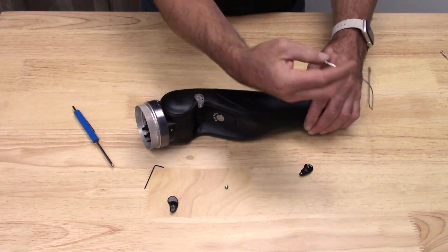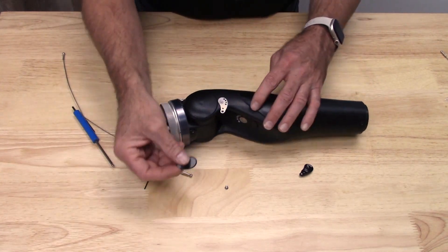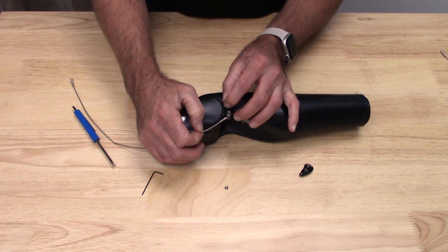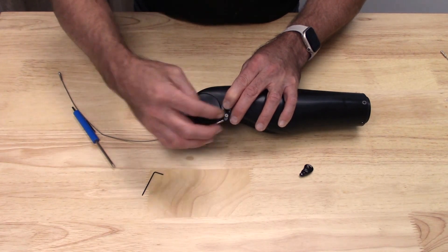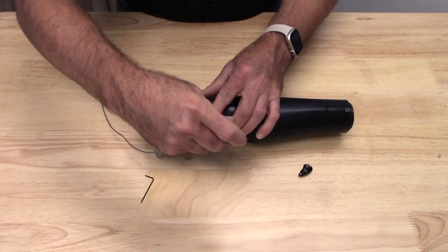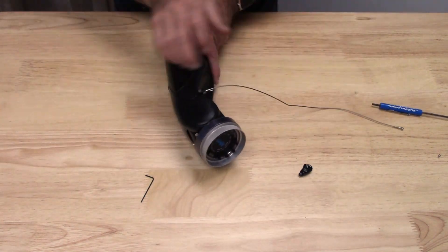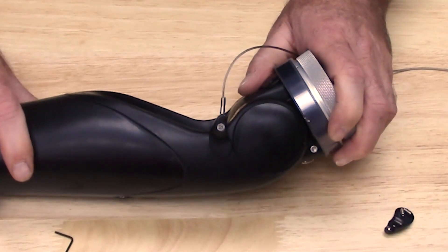The next thing I'm going to do is grab my ball terminal and my lift tab assembly cover, and I'm just going to secure everything down with that second Phillips head screw. Just make sure everything's nice and tightened down there, and that is what a properly installed lift tab assembly will look like.